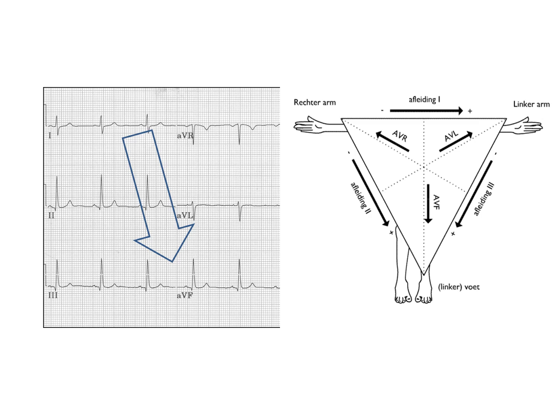So electricity, if it's going perpendicular, could be going almost straight up or almost straight down. We know it's not purely perpendicular because there is in fact a little bit more positive charge than negative, so we know there must be a slight leftwards horizontal component. So it's angled a little bit left and up or a little bit left and down.